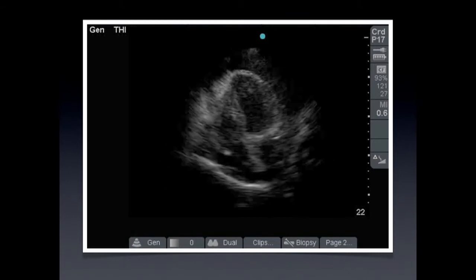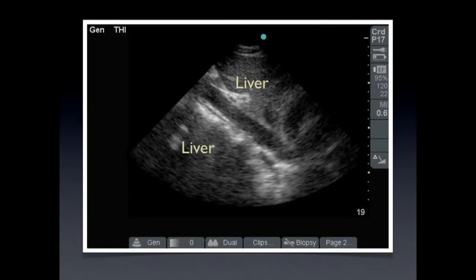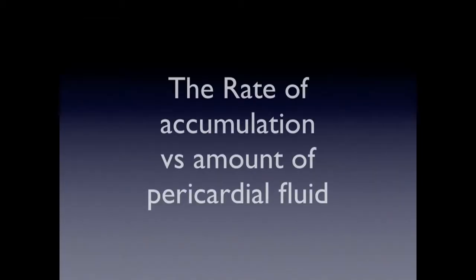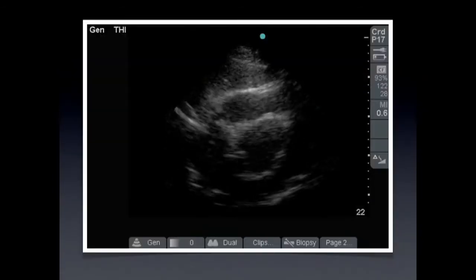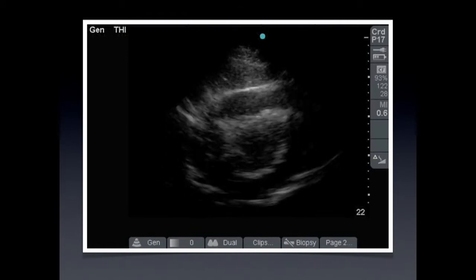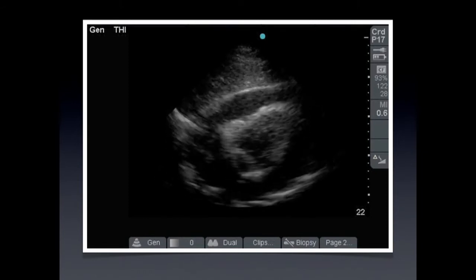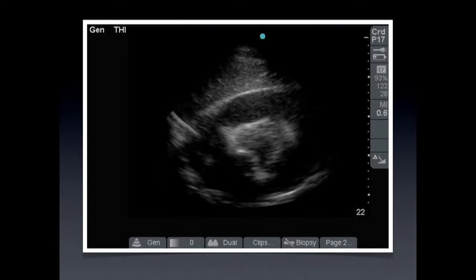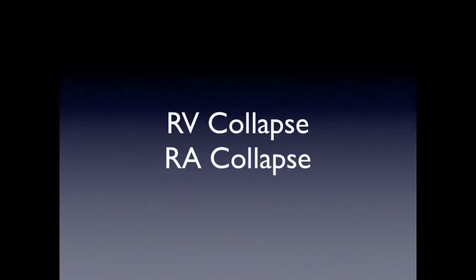In the four-chamber apical view, we see right ventricular collapse and right atrial collapse, also indicative of tamponade. The inferior vena cava, which should be collapsing, is not collapsing due to increased pressure — another sign of tamponade. The rate of accumulation is more important than the amount. Some people with chronic effusions may accumulate a large amount of fluid, but the literature says about 150 mLs of fluid are sufficient to cause tamponade. A trauma patient with a stab wound to the chest is not going to do as well as somebody with a chronic effusion.